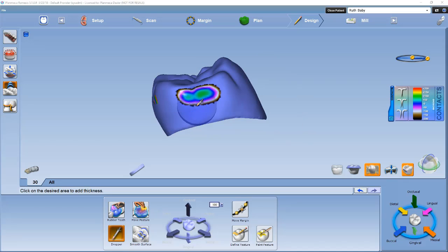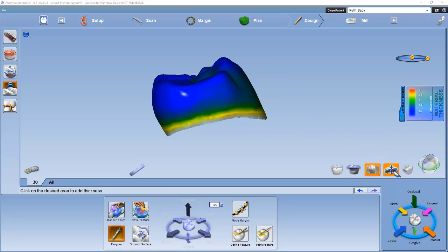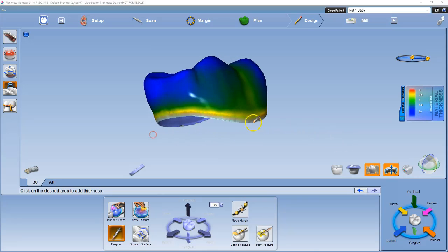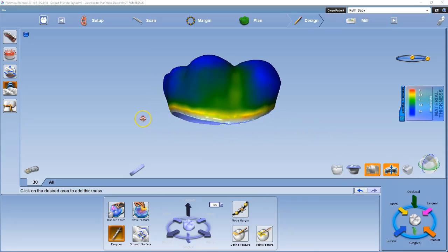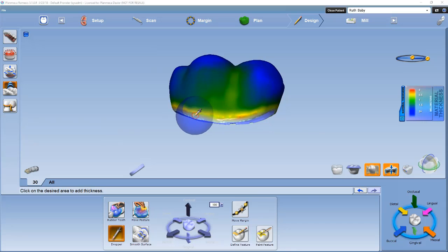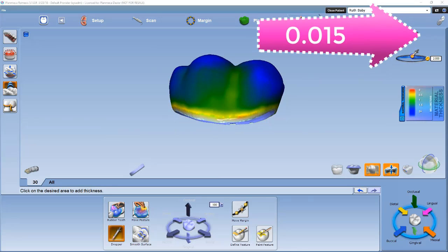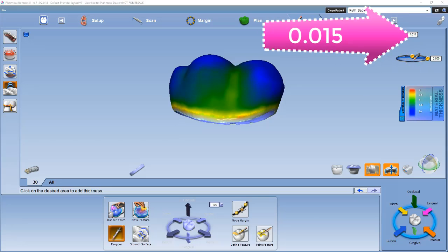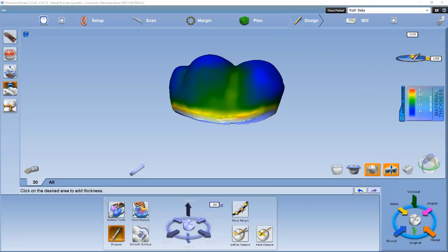Referring back to the workflow sheet, you will see the dropper tool to correct the thin areas along the margin. Remember, the margin should be evaluated and adjusted with move margin before adding material. I will adjust the vertical sphere down to 0.015 and leave the surface area alone. This will prevent me from creating a bulky margin or changing my contours of my restoration.